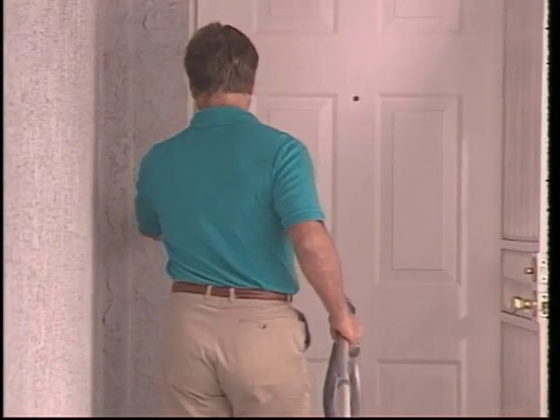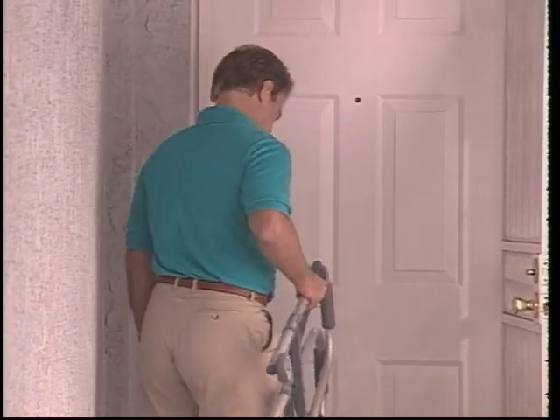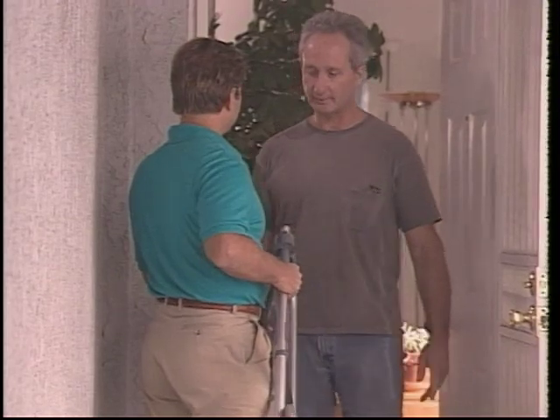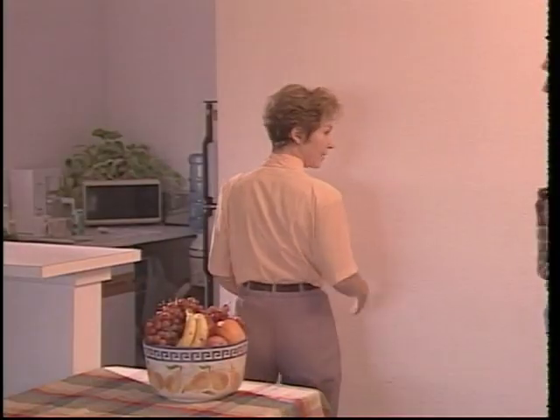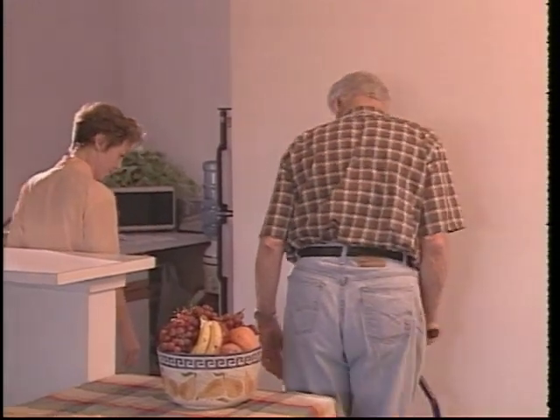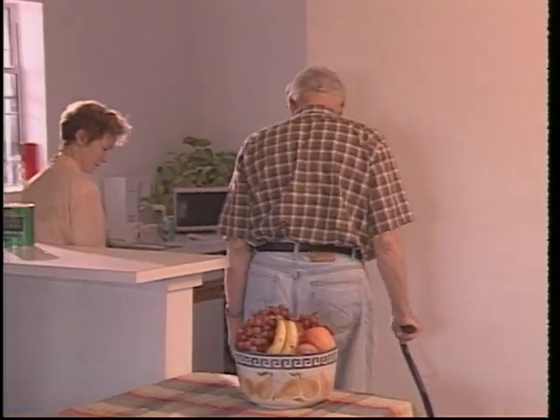Now, a proper home assessment concerns many people. I'm a physical therapist, and one of my responsibilities is to assess the home environment for as long as a client is receiving our services. This is Brad, a service technician. He also evaluates the home to ensure the safe use of mobility devices he delivers. This is a little narrow. Why don't you turn sideways? And your left foot first, then your right. And this is Cora, a nurse, with her patient, Cloyd Howard, who recently had a total knee replacement.